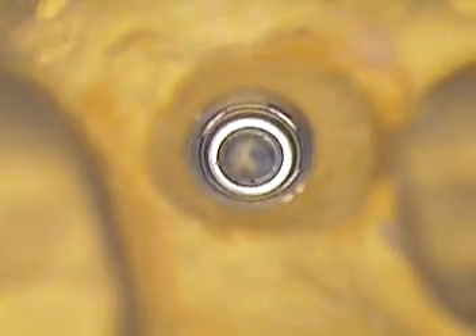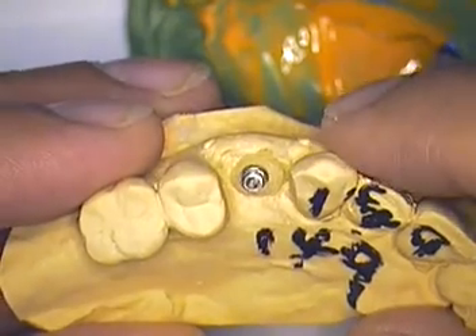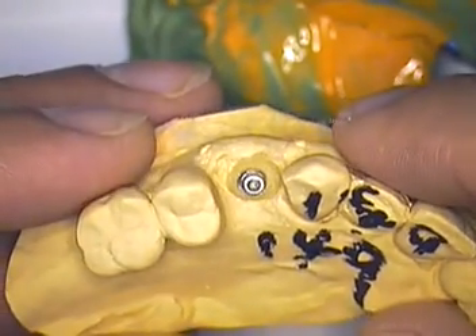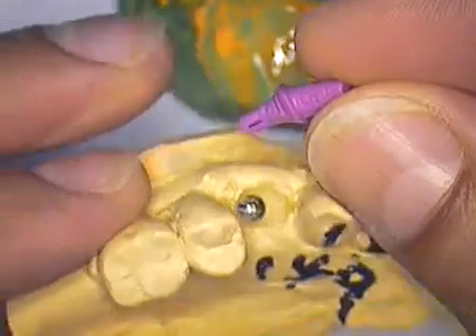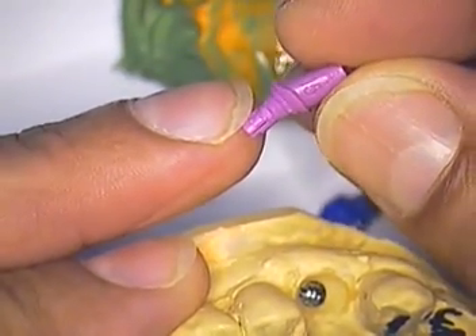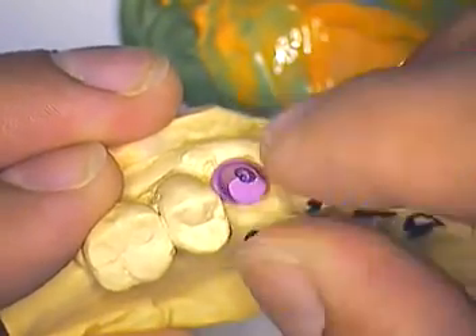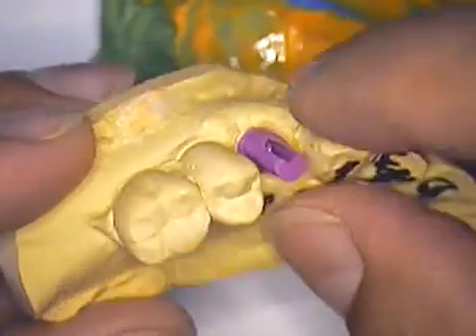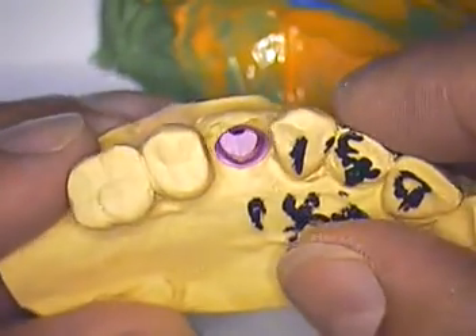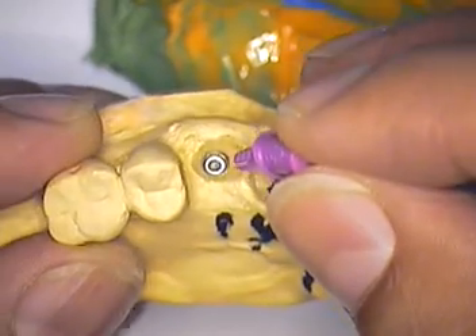Now the laboratory technician has the option: they can either go with making a custom abutment, or we can try in these little plastic trial copings — they all have little numbers on them. This one happens to be a 15A and it's angled at 15 degrees. So we're going to slide that in place and get an idea of how we're going to handle this case. We know it's going to be an angled abutment. The question is: are we going to make a custom, or are we going to pull one off the stock shelf and just modify it somewhat so we can use that?